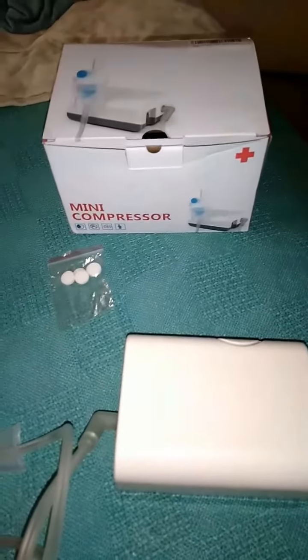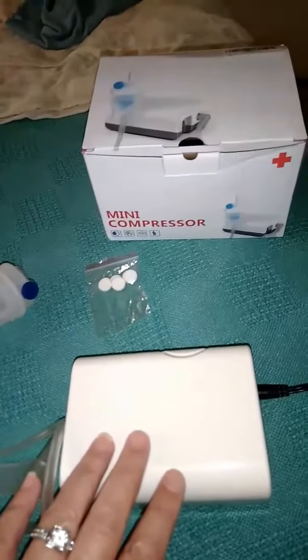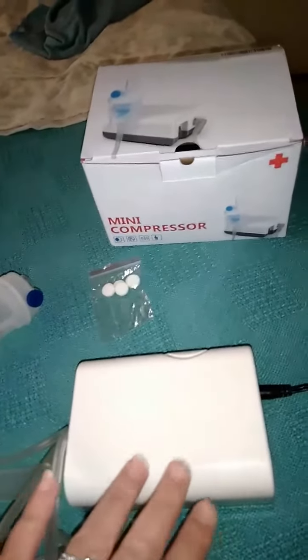I'm done with this review on the mini compressing nebulizer. This is small, compact, easy to carry, taking along with you anywhere you need it, which is nice.